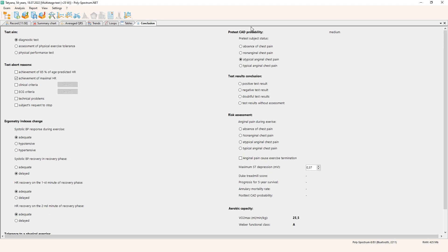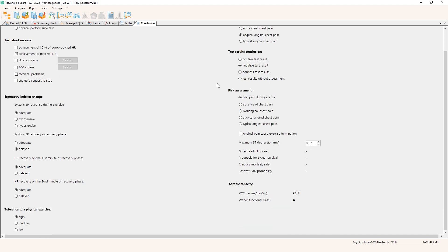Tolerance to physical exercise is assessed according to the maximum workload achieved — we have 100 watts, even 125 for a short period, so we can mark it as high. The pre-test probability was assessed before the test. In our case we didn't have any ECG ST segment change, so we can mark the test as negative. The 'without assessment' position should be avoided — it applies when 85 percent of predicted heart rate is not achieved and there are no clinical or ECG signs. In our case we have a maximum test with no ST depression, so the test is negative.